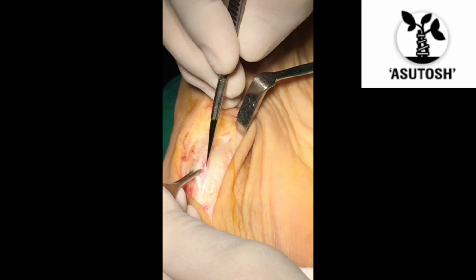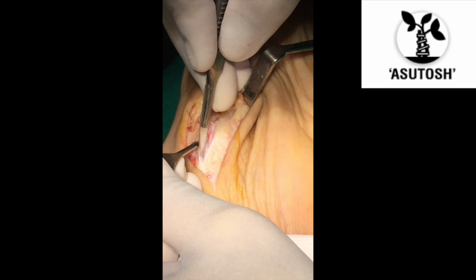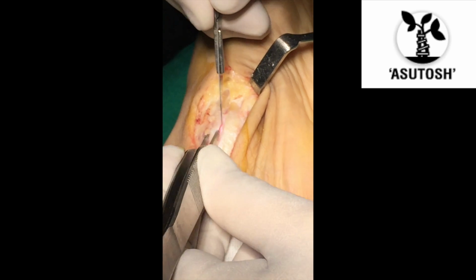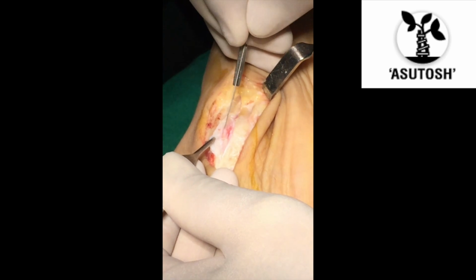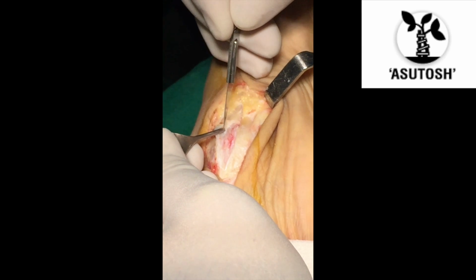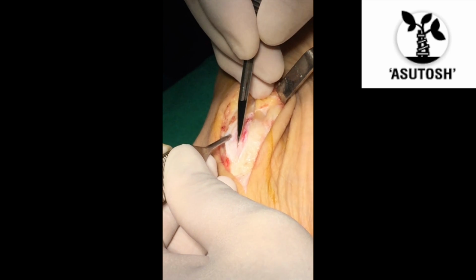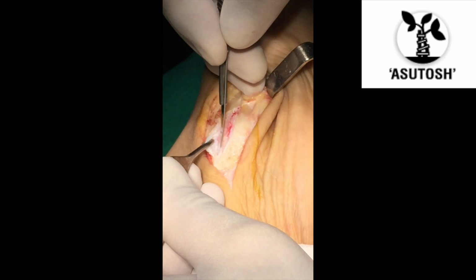The tendon is attached to the navicular bone by strong Sharpey's fibers, so it is a bit difficult to elevate it with a knife too. However, we just split it enough to isolate the medial portion of the accessory navicular and a bit of the navicular that is seen as a bump.